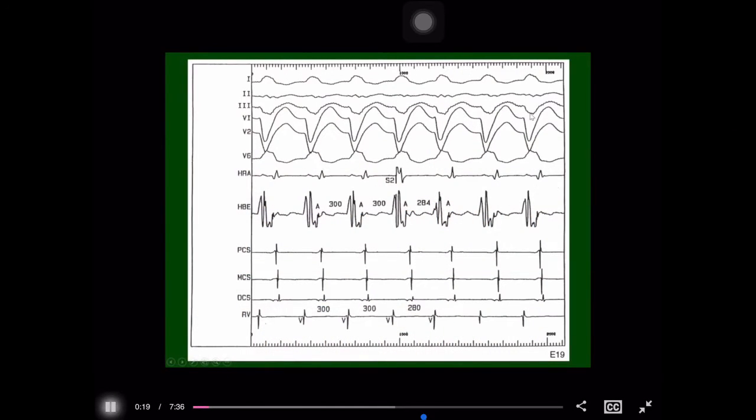Here is a sustained left bundle tachycardia. Please note, even though the paper speed is sort of fast, this is a classic looking left bundle. So it would be a typical left bundle and that's important to note.